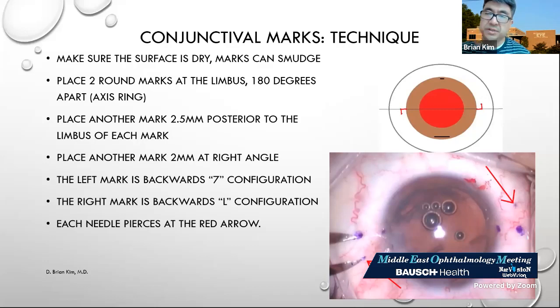Yes, so the 6 o'clock position, or the contra-incisional paracentesis, is where I'm going to externalize the leading haptic, and that's my modification, and I'll talk about that shortly.